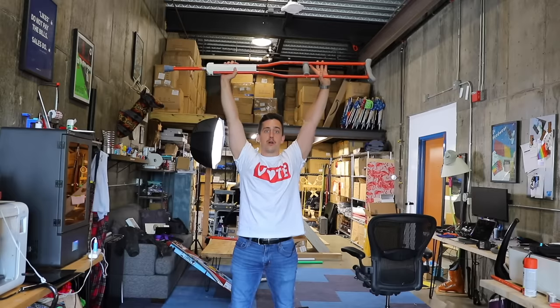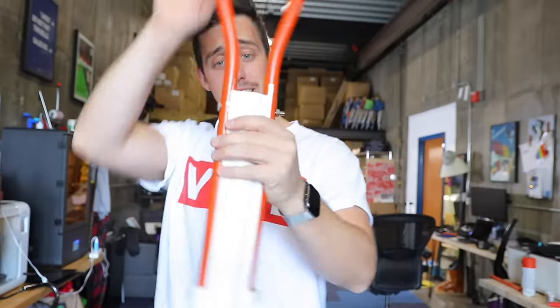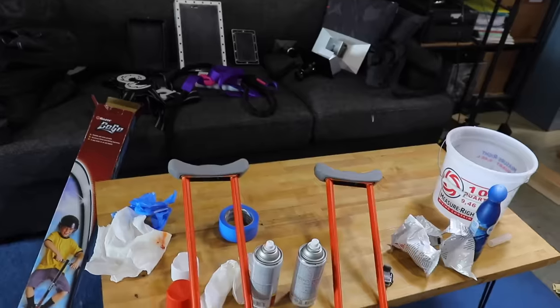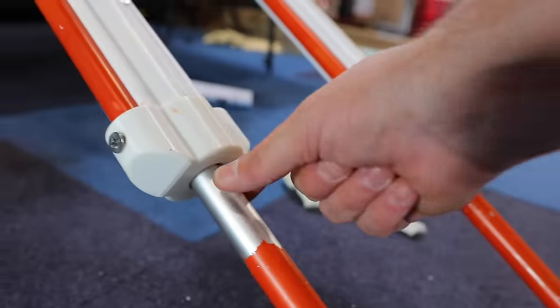We have assembled a pogo crutch! Not too bad if you ask me — the white and orange combo is looking pretty good. Time for the official test. It definitely bounces!